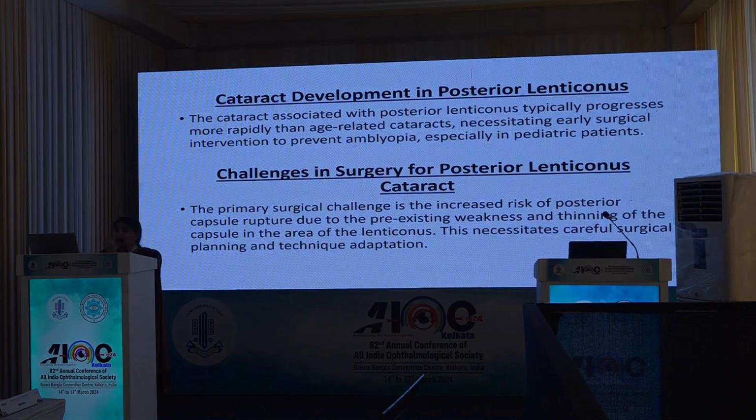Cataract associated with posterior lenticonus typically progresses more rapidly than age-related cataract and is usually seen in pediatric cases, so it necessitates early surgical intervention. So what is the main challenge? The main challenge is posterior capsule thinning. So there is already a pre-existing weakness.